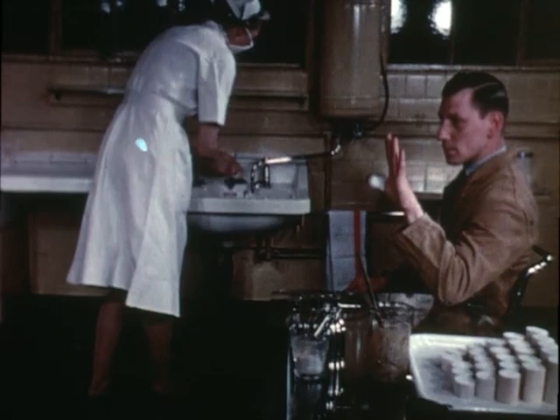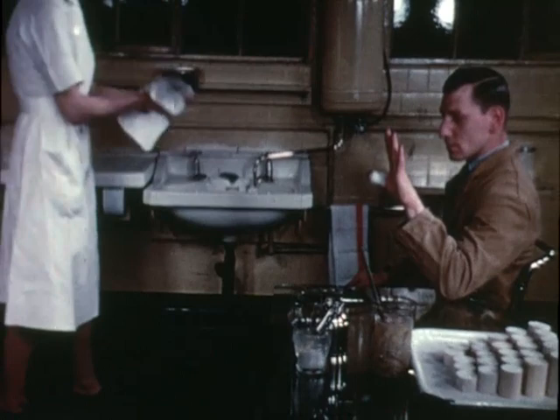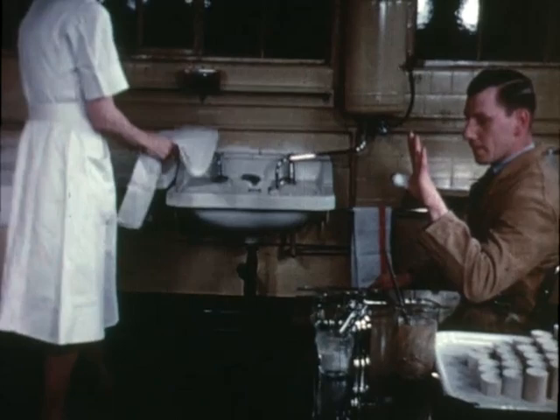This wash is simply to remove any bits of infected dust or fluff that might fall onto clean material. It does not sterilize her hands, but since they never come into contact with the wound, complete sterility is not necessary. Her hands must be dried to prevent any drops of water getting into the wound.